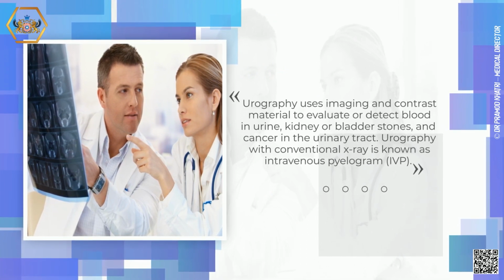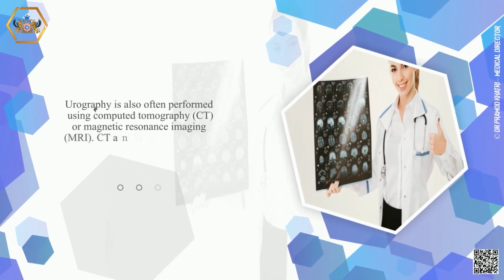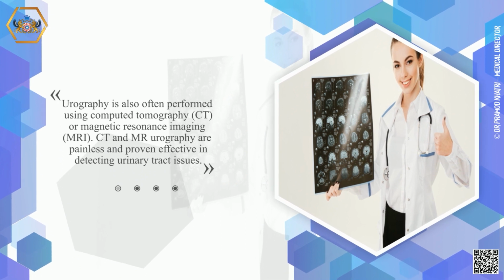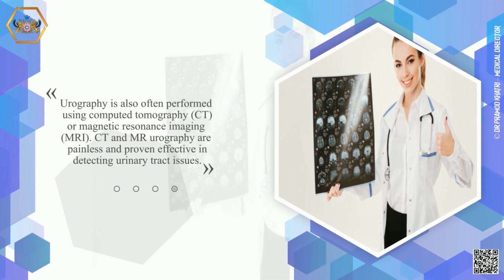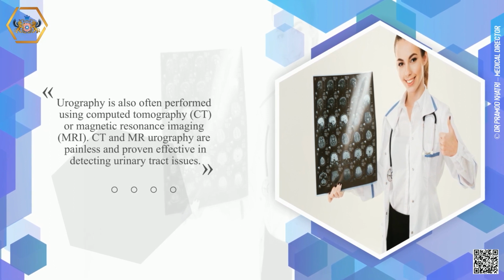Urography with conventional X-ray is known as intravenous pyelogram, IVP. Urography is also often performed using computed tomography, CT, or magnetic resonance imaging, MRI. CT and MRI urography are painless and proven effective in detecting urinary tract issues.